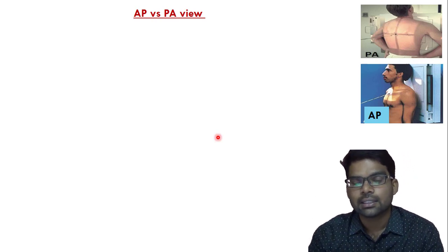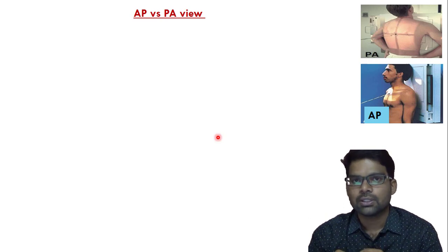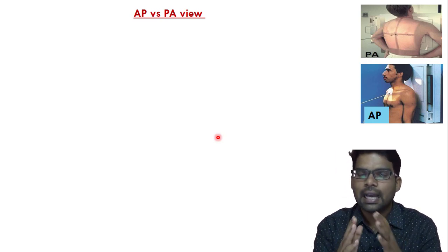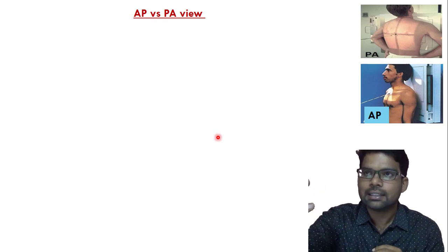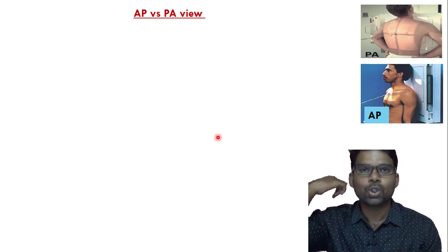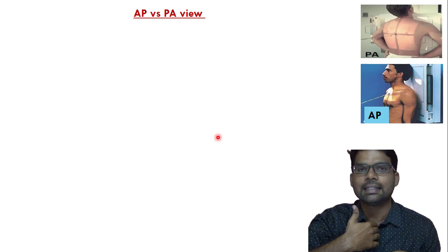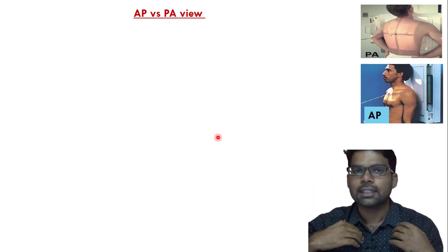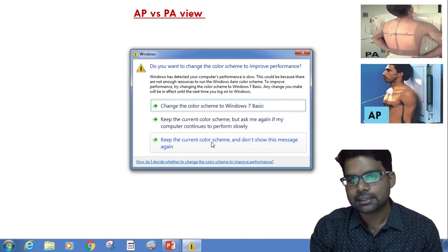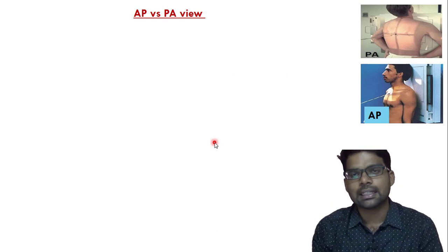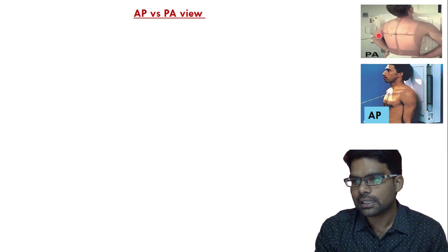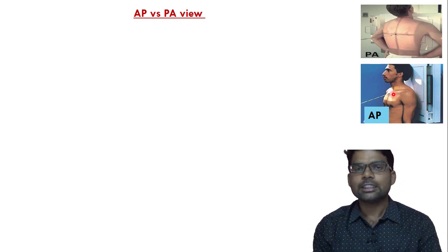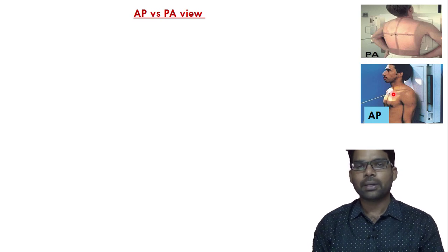The next important topic: differences between AP view and PA view. AP stands for anterior-posterior view, meaning the X-ray beam is projected from anterior to posterior. PA stands for posterior-anterior view, where the X-ray beam is projected from posterior to anterior. In an AP film, the patient stands and exposes the chest with shoulders going away from each other, so the inner borders of the scapula come closer together in the midline.